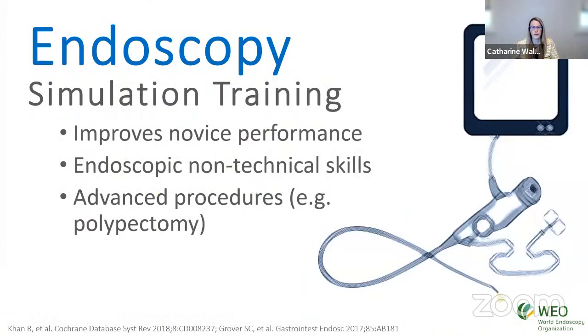There's been a number of systematic reviews done that have demonstrated the effectiveness of endoscopy simulation-based training for primarily novice endoscopists to promote acquisition of skill and improve their performance of initial procedures, and also to accelerate their learning of the skills. And as I mentioned, there's also some evidence that it can be used for training of non-technical skills.